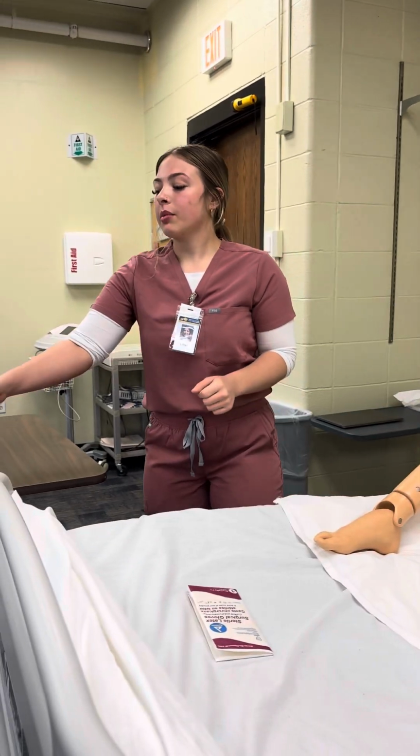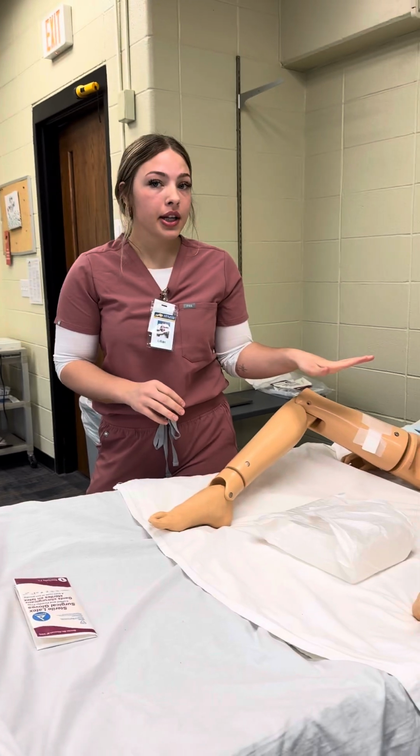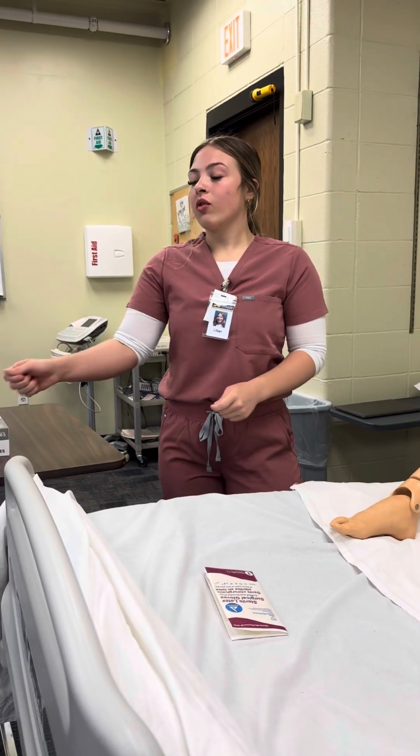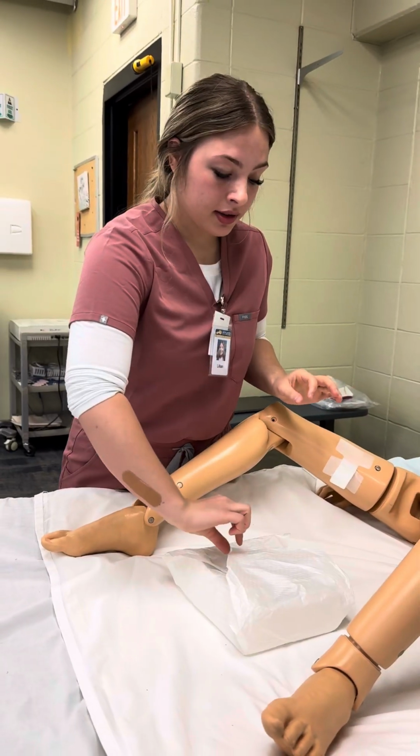So what I'm going to do is I'm going to perform hand hygiene and put on a clean pair of gloves, and then I will perform pericare. Once pericare is complete, I would take off my gloves and perform hand hygiene. And then next I'm going to go ahead and open my box.